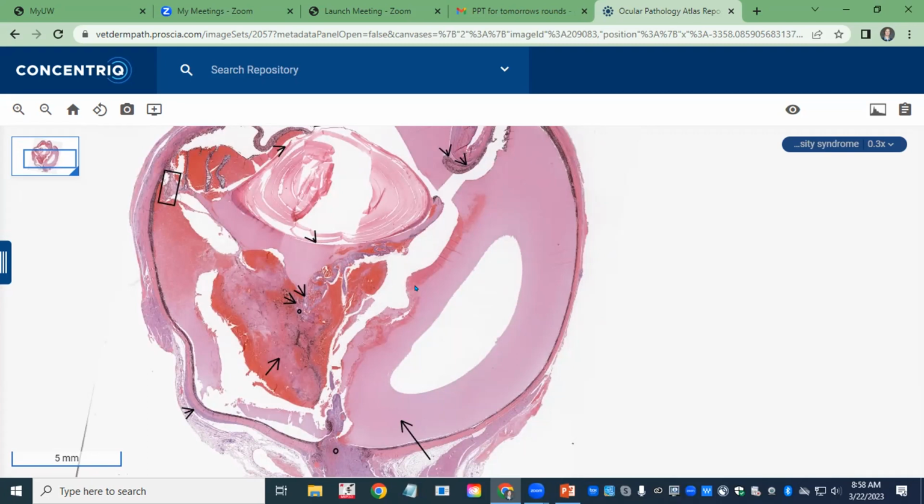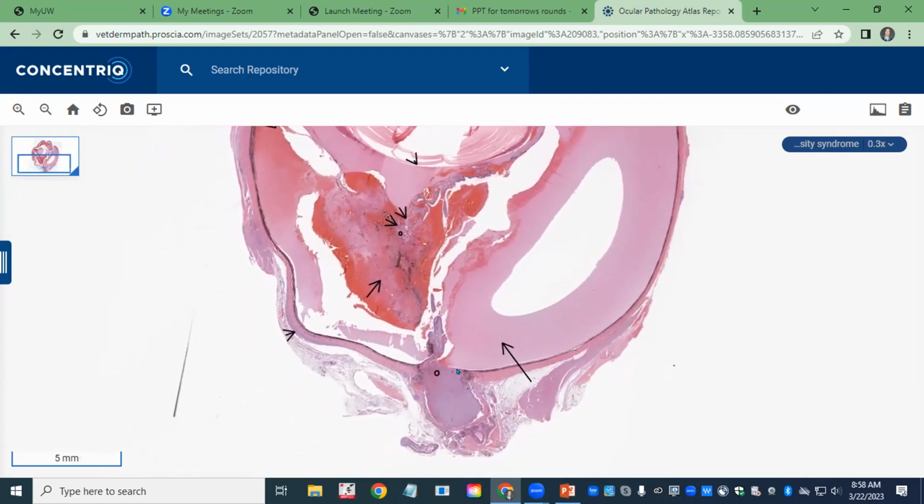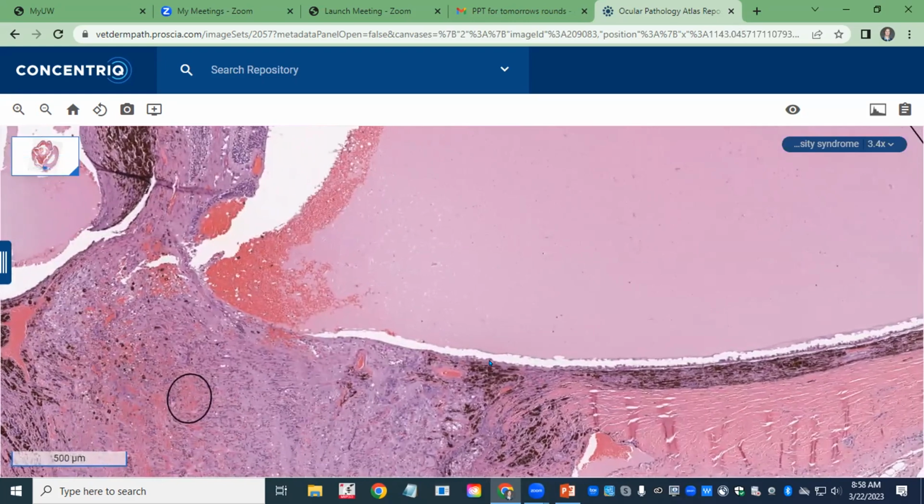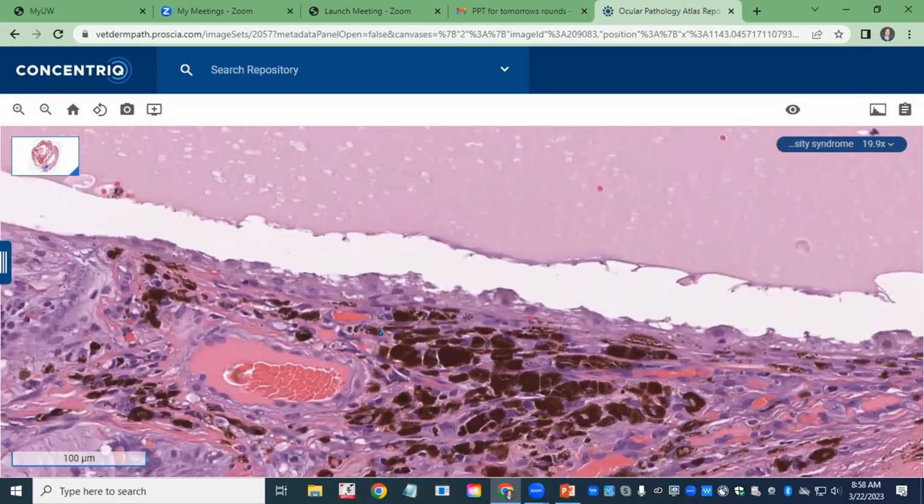And also with hyperviscosity syndrome, the stuff that's leaking out of the vessels that's high protein is the same as the serum that's in the blood vessels. So if you go to the choroid in particular and find blood vessels, and I'm not sure if it's in this case or not. This case didn't have great ones. I presented this case for MIVP, but we can look. Yeah, this is... sometimes, well, that's actually a good one right there.